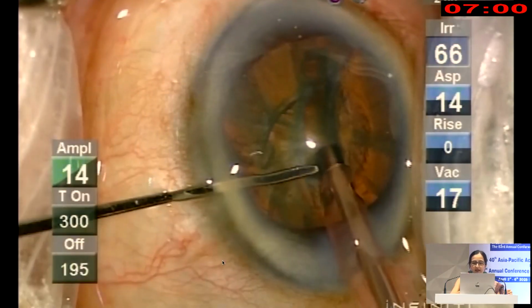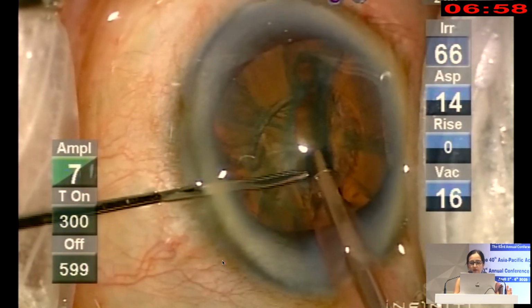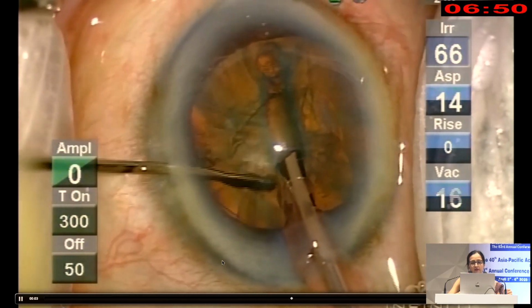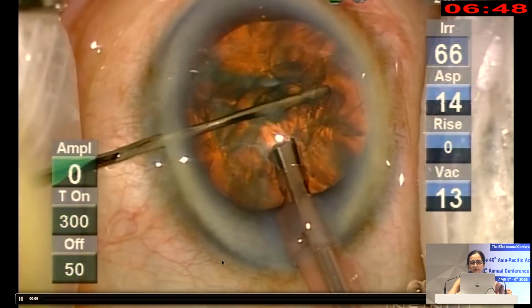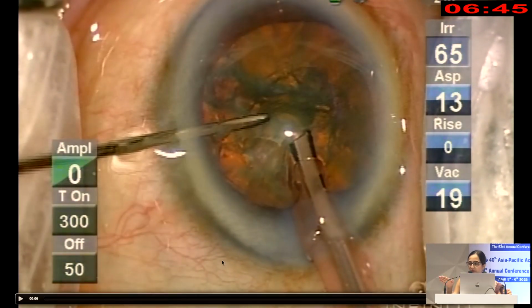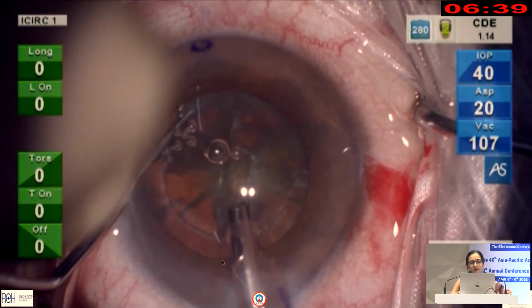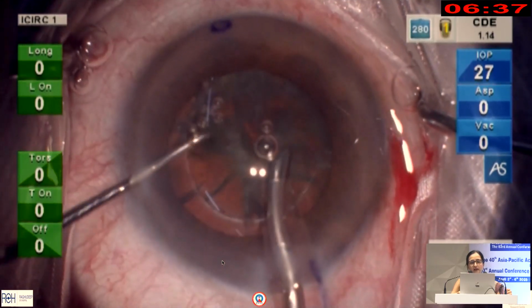Now not every time will this rotation work perfectly or completely the first time. This case I have put up to show that a sculpt is being made, and this is what we call an ideal rotation. You don't press, you just stay on the surface and do a swiping rotation movement with your wrists. Now here a chop has been created. You can see here that the surgeon is struggling to rotate.